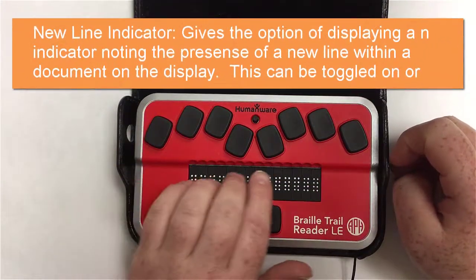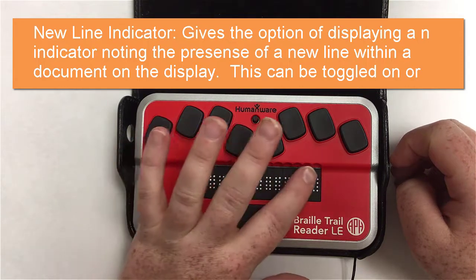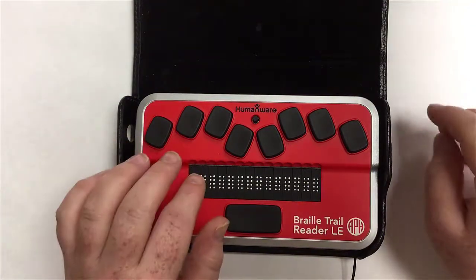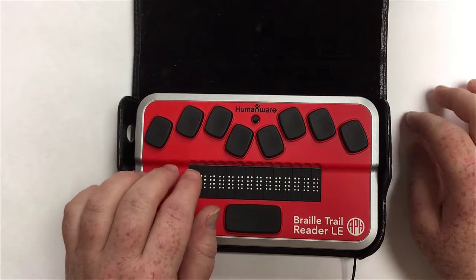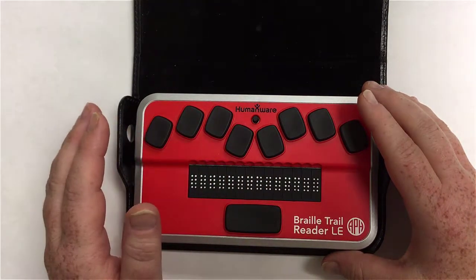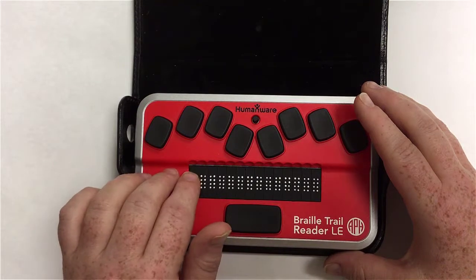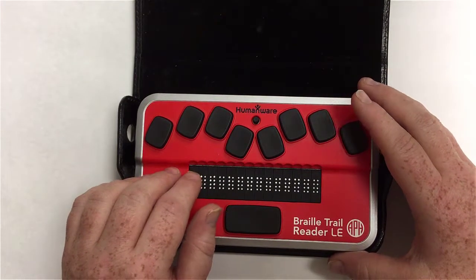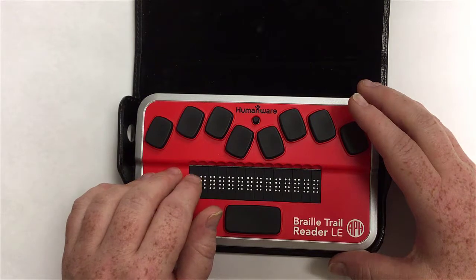The next option is new line indicator, another on/off toggle. A new line indicator is a full-cell indication placed between items that are on different lines. For example, in a grocery list — milk, bread, pickles — rather than navigating to a new line each time, you'd see a full cell between entries. With only 14 cells to work with, it helps move things along. You can experiment with it and turn it on or off as preferred.